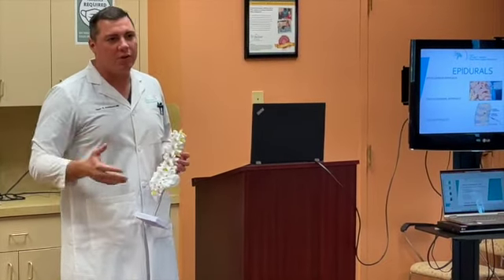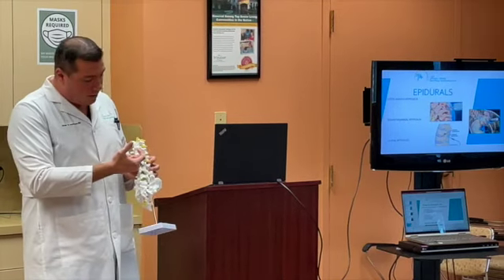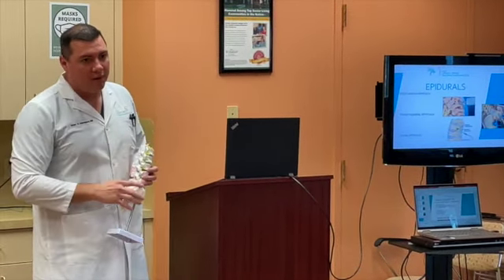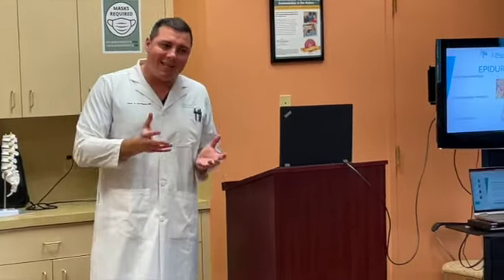That's why you've heard of a series of 3 injections. It's because of that. So now, instead of going in here, we bypass that and we go right there, right? And a lot of times you can get away with 1 injection. Sometimes you may need a second.